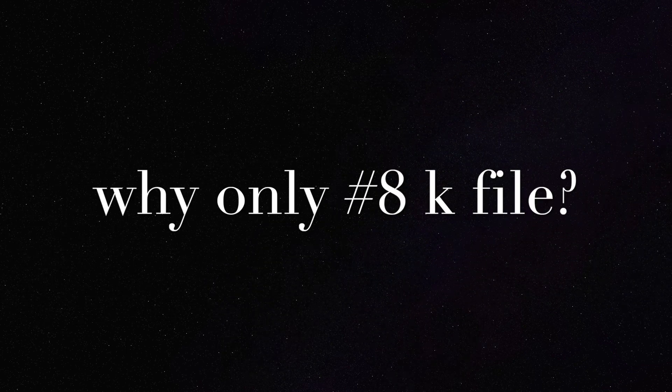The last discussion is about why only an 8 size K file is recommended. The reason is that an 8 size K file is flexible enough and soft so as not to create any ledge or alter the shape of the existing anatomy, which might happen in case of a 10 size file or a 15 size file. That is the reason we recommend the usage of only an 8 size K file in this technique.